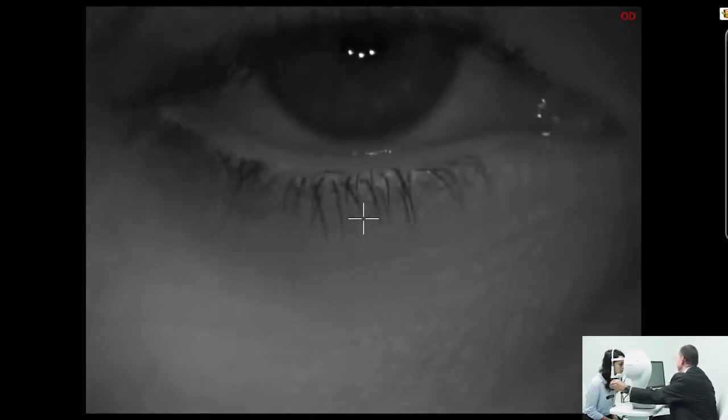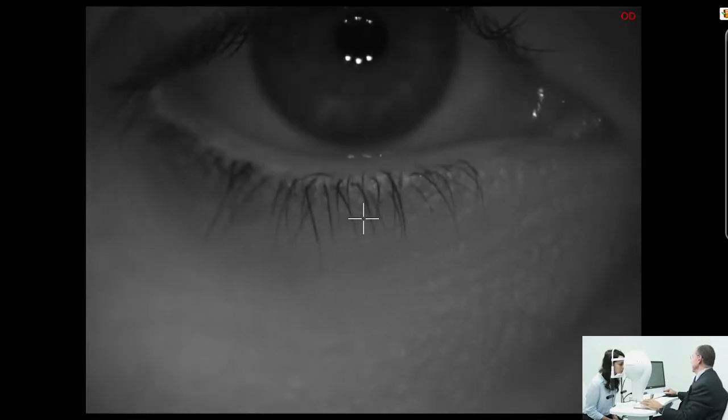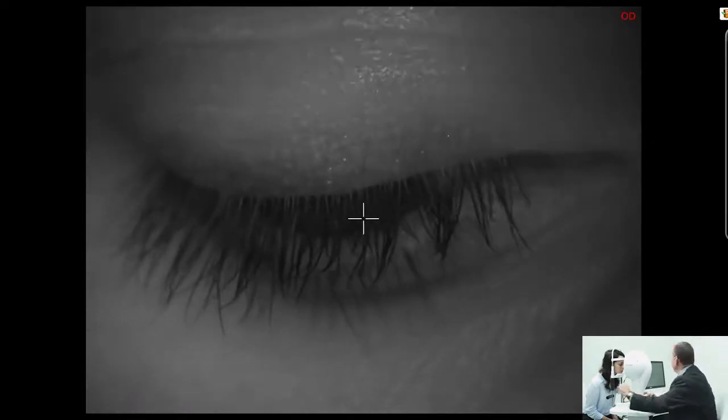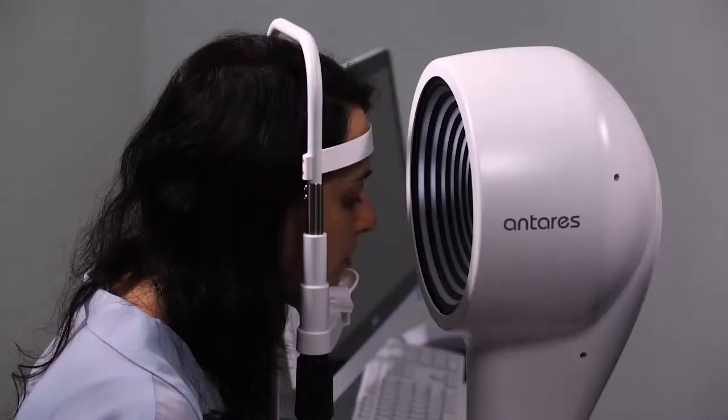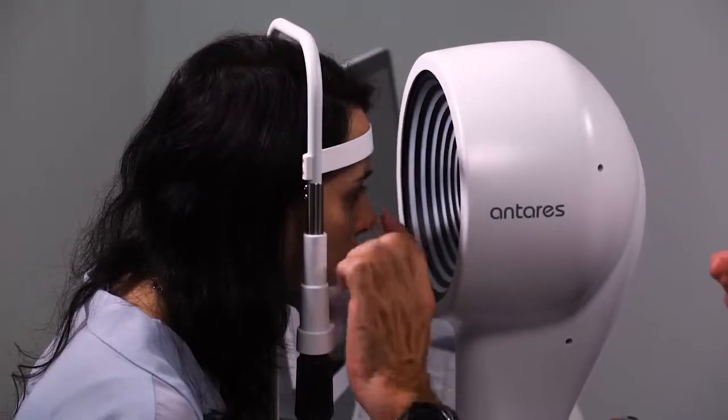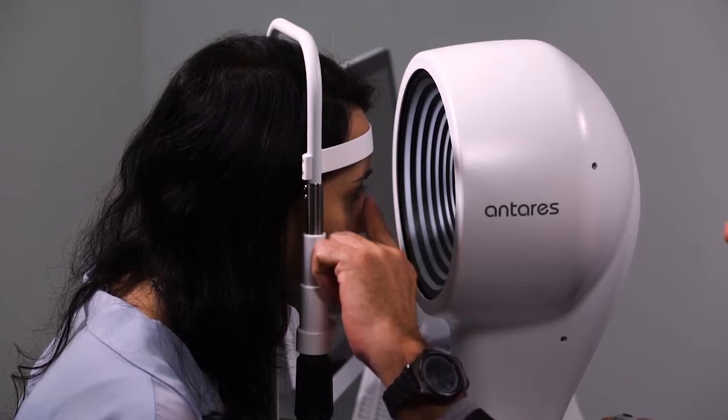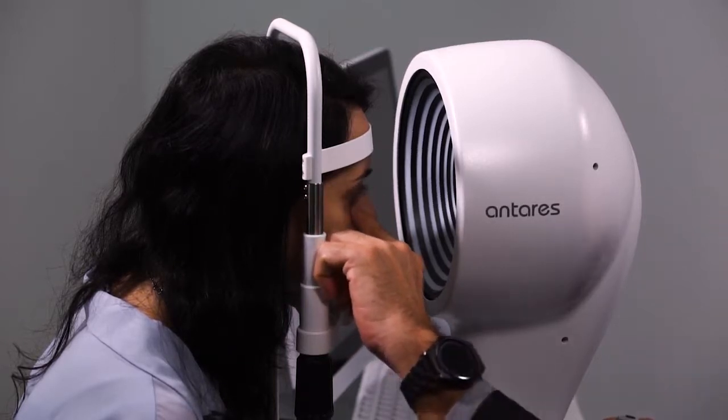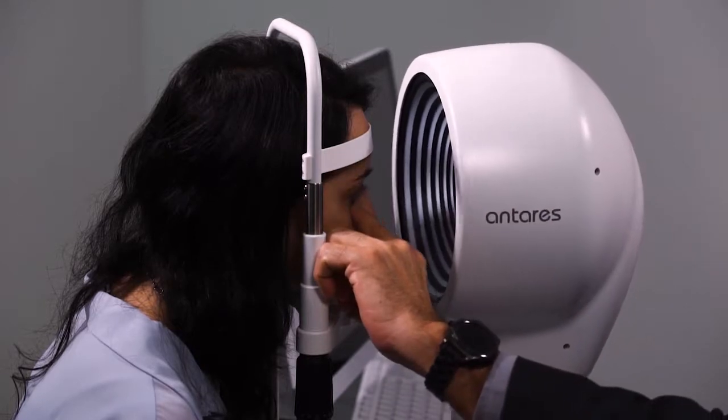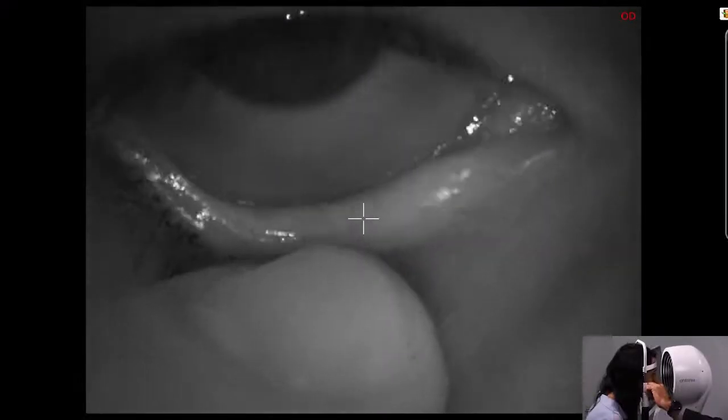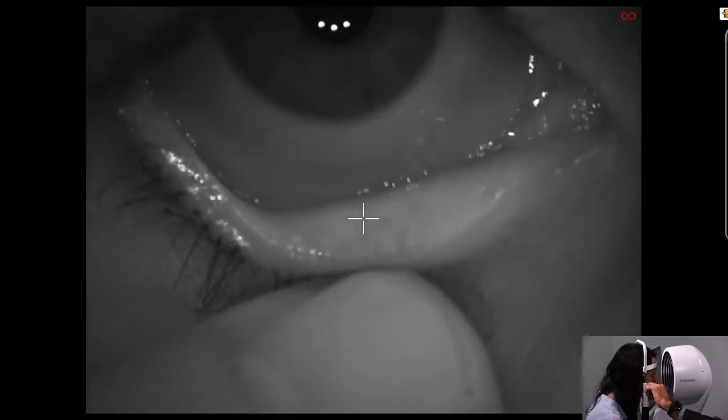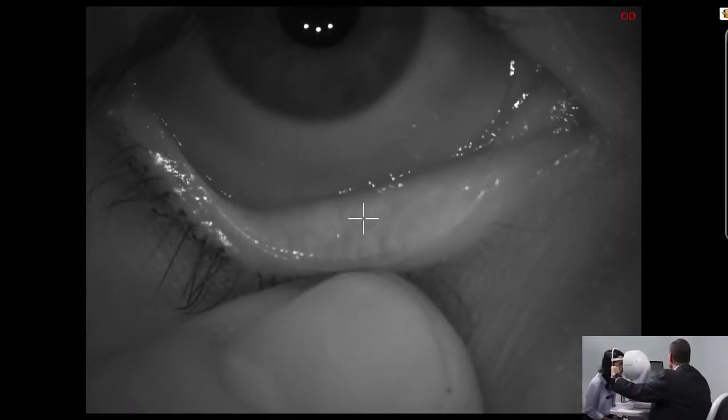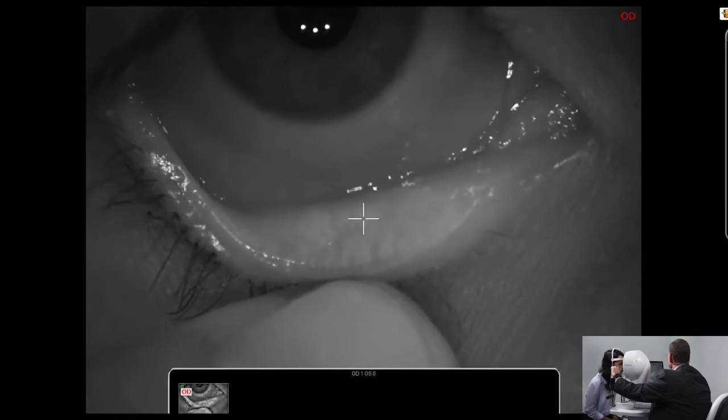So we're going to have the actual lower lid slightly higher in the image. Now we're going to basically look up please, straight up, and we're going to expose the meibomian glands. Excellent, perfect, you're doing great.